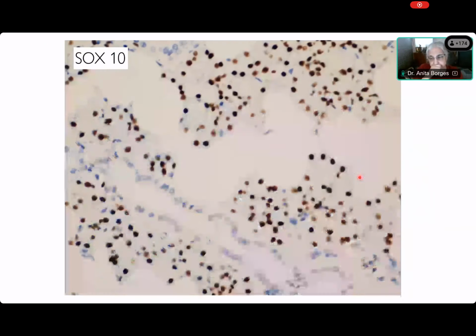Now here is SOX10. SOX10, we often use it, of course, to look for melanocytic or neurogenic differentiation, but it's become quite important in salivary gland histopathology because it marks basal cells and myoepithelial cells. It is incredibly well seen in acinar cells. Now you see all these big nuclei that you're seeing here. These are not myoepithelial cells. They are round nuclei. Myoepithelial cells have very delicate oval nuclei. So what are these big round nuclei that are marking with SOX10? And lo and behold, it is actually the acinar cells.